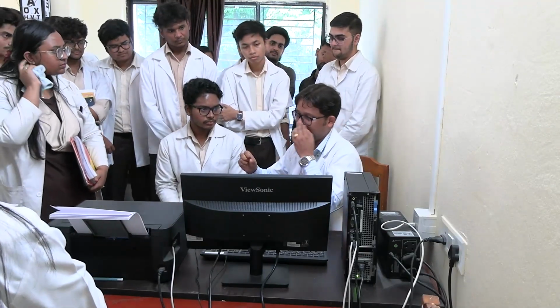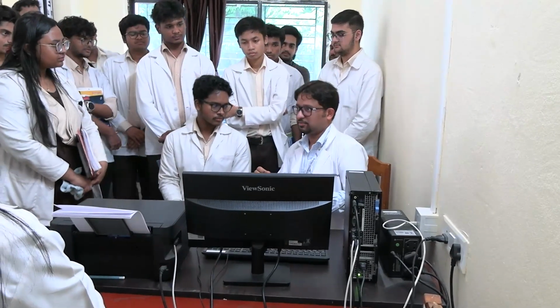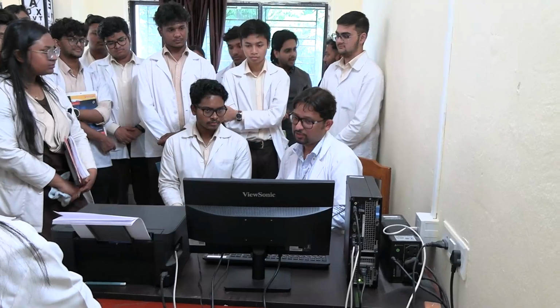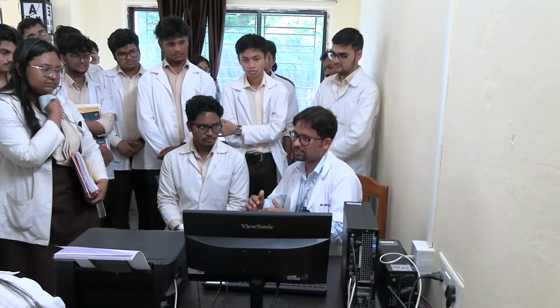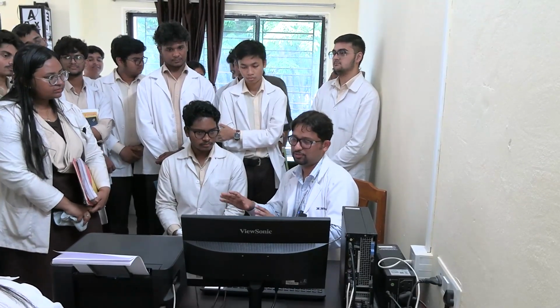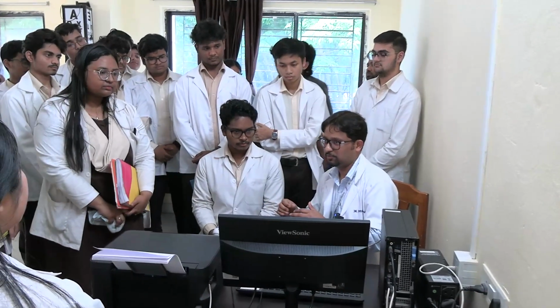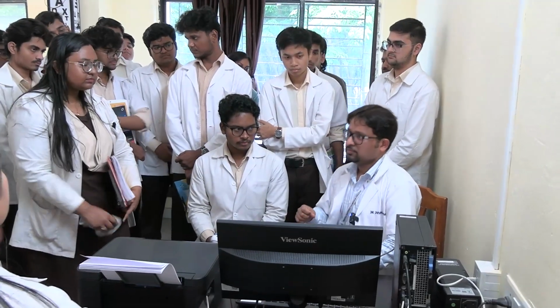Suppose I have the device in my hand. So you sit straight, right? After rest, of course. So breathing has to be resting or stabilized first. Only after stable respiration this has to be done. So 4-5 minutes you have to give for this breathing pattern to be stable. Right? So then you have to take a deep inspiration with our nose.